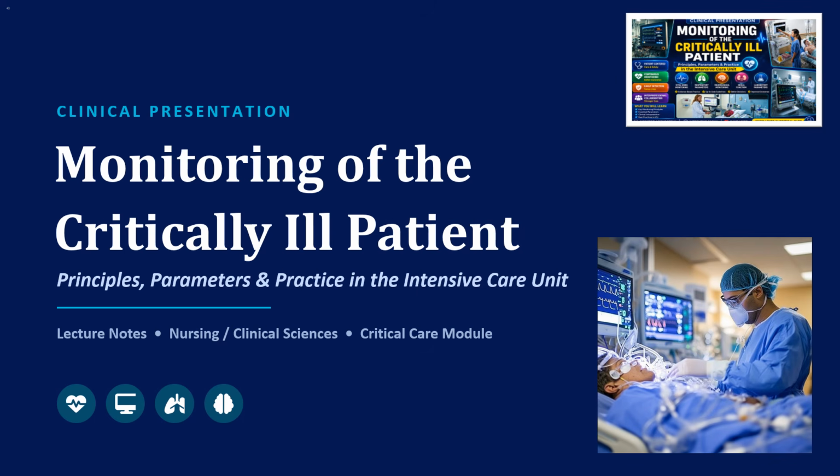Clinical presentation. Monitoring of the critically ill patient: principles, parameters and practice in the intensive care unit. Lecture notes, Nursing Clinical Sciences, Critical Care Module. Focus. 1. Core principles of ICU monitoring: accuracy, continuity and early detection. This ensures subtle deterioration is recognized before it becomes life-threatening.